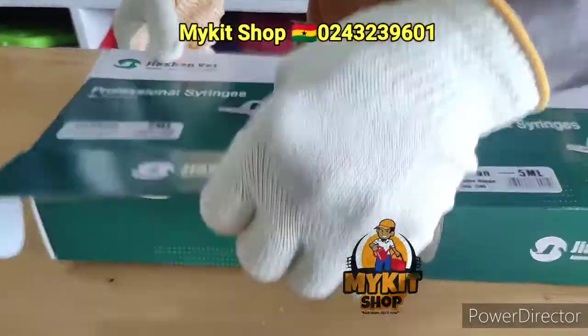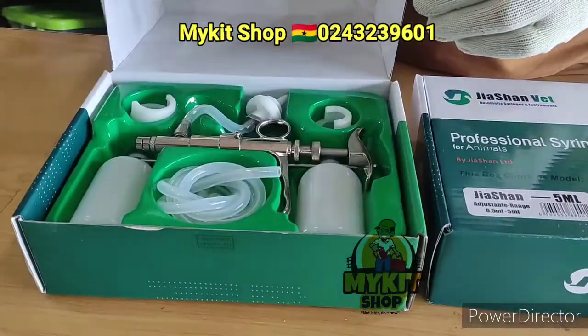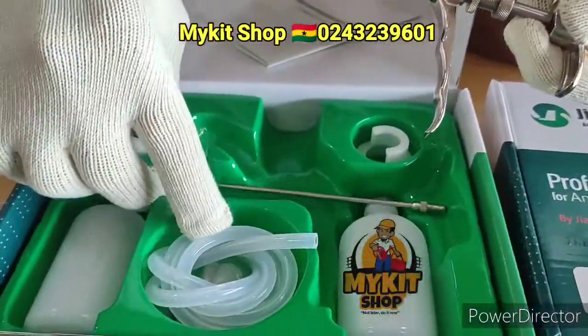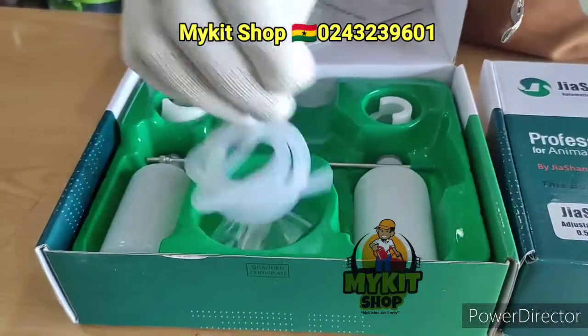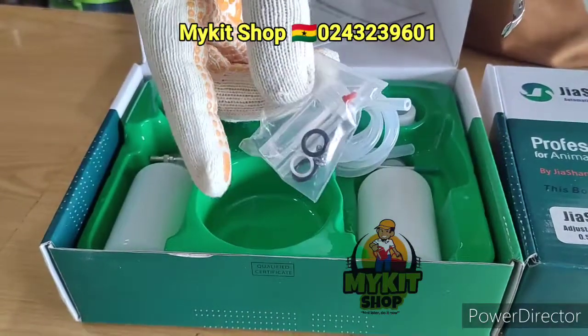When you buy them, they come with a manual, the automatic syringes, a tube for sucking the medicine, two bottles, and a tube. We also have the needle and some lubricants included.